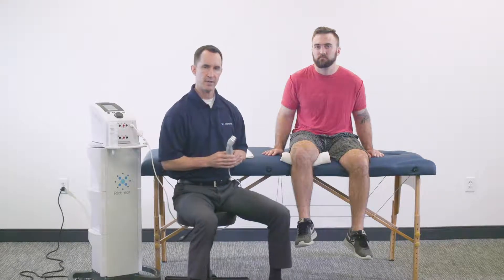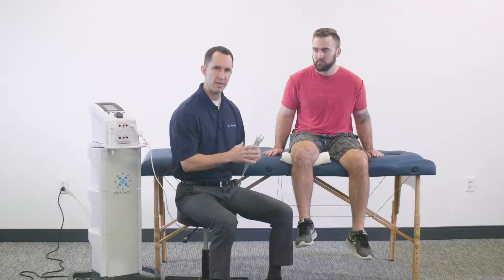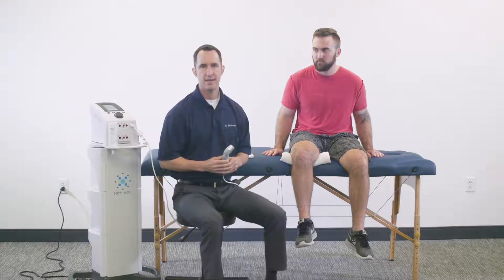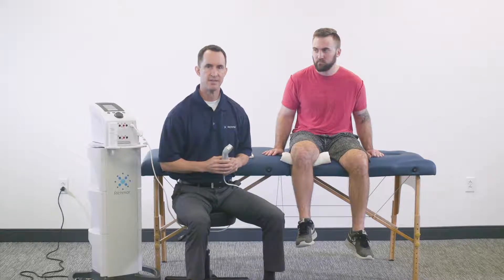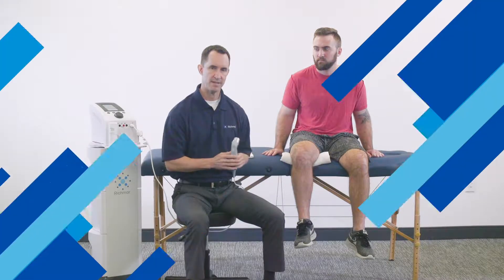Another clinical notation: toward the tail end of your treatment session, as the tendon starts to loosen up and becomes nice and elastic, you just want to apply a gentle stretch in the last minute or so. After the treatment session, you're talking about a stretch window of about three to five minutes.